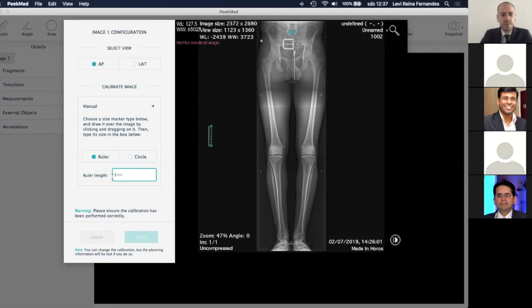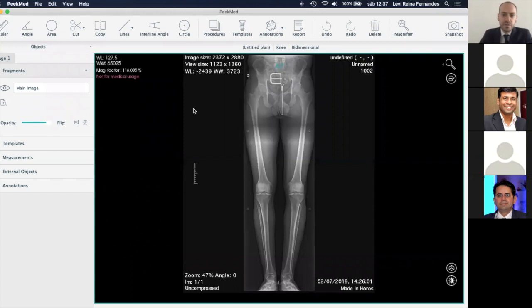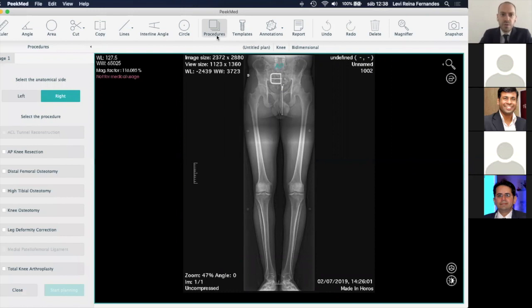So now the image is scanned. Now you do need to go to the procedures. And this patient, actually, I apologize, this patient is wearing pants, but there's a story behind it. We got a new long leg x-ray in our hospital. I was feeling a little sore on my left knee, so I went there to check it out, and this ends up to be my own x-ray.